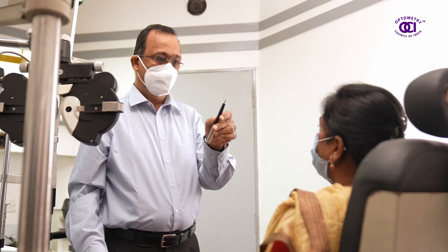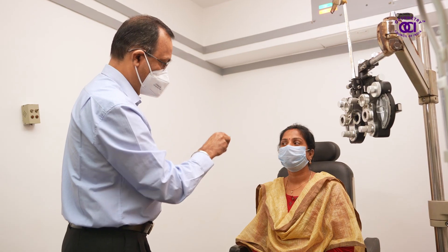Tests are also done to find if both eyes are in coordination in terms of functioning in unison.